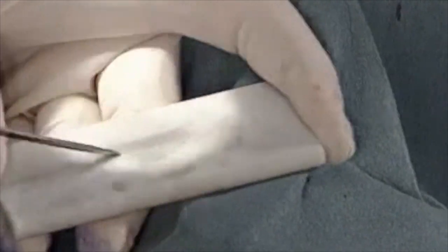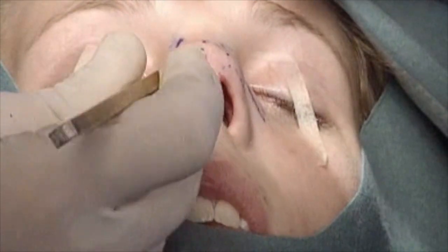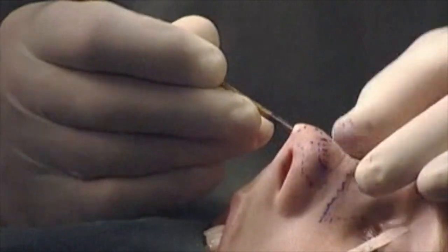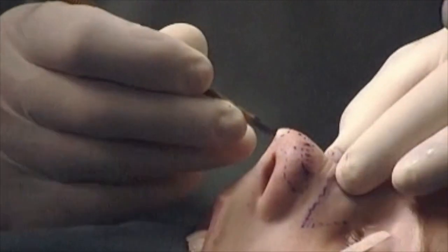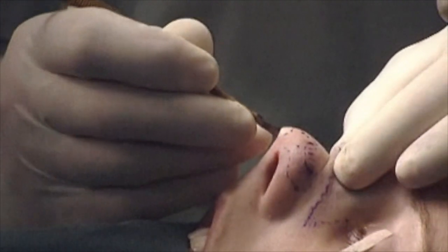So now I'll introduce the 3mm osteotome, and we go as high as possible in the open roof to find the site to make the osteotomy. So we can start here.